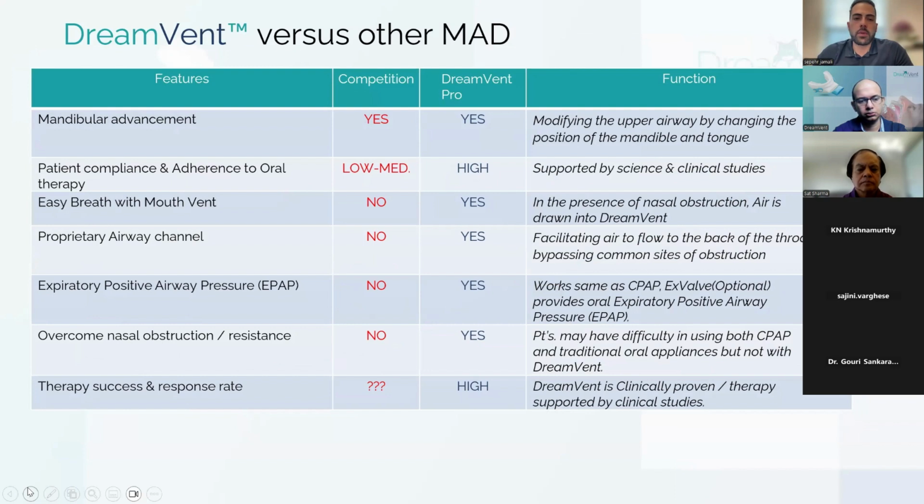And some of the severe patients that we had, with the high resistance ones, are still getting some benefit. Sometimes they may not even use their CPAP. Even though it's not a cure, it still improves their sleep so much that they don't need to bother to move their CPAP onto the airplane if they're traveling, or if they're going camping. So it gives a better alternative even for patients who have to use the CPAP. At least they can have something comparable to that.